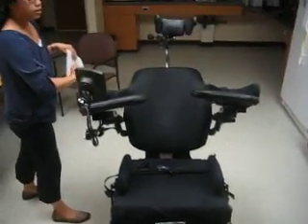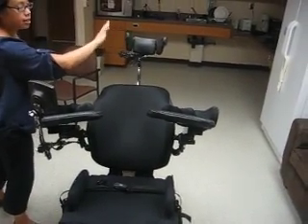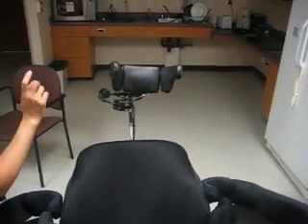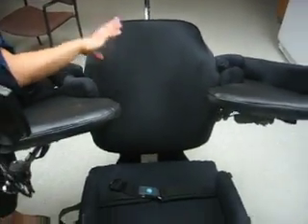Avoid the temptation to use tools to change the position of the head array. The head array has been positioned after many hours of trial in the exact right position. If the patient feels the head array is out of position, it's very likely his position in the chair where he sits is the problem.